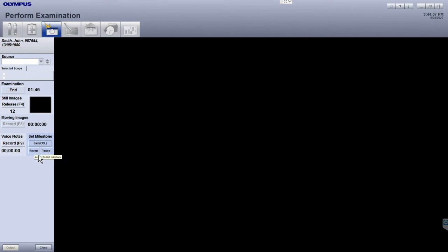Pressing the Revert button allows you to go back to the previous milestone, so the duration can be recalculated.